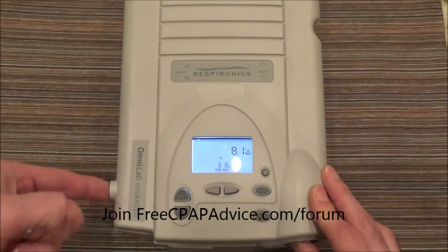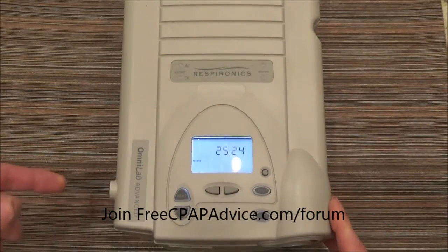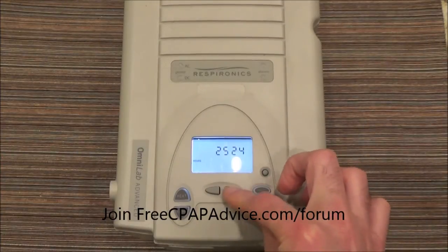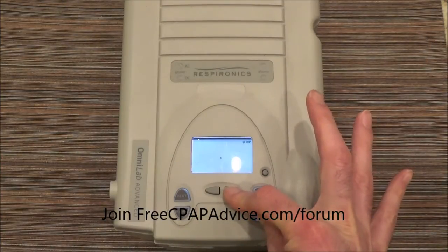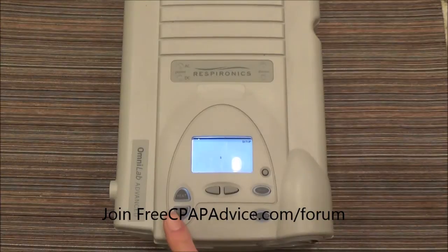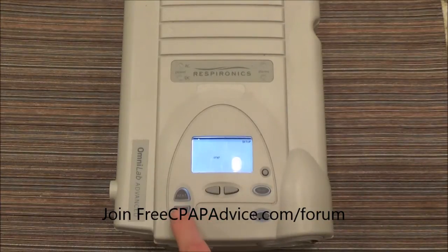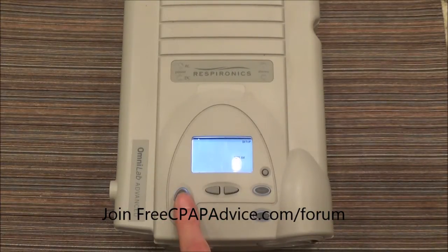You can turn it off by hitting on the side here, and then we're going to need to get into that menu again. Now let's take the patient and give them a try on Auto SV, so we're going to toggle to Auto SV.